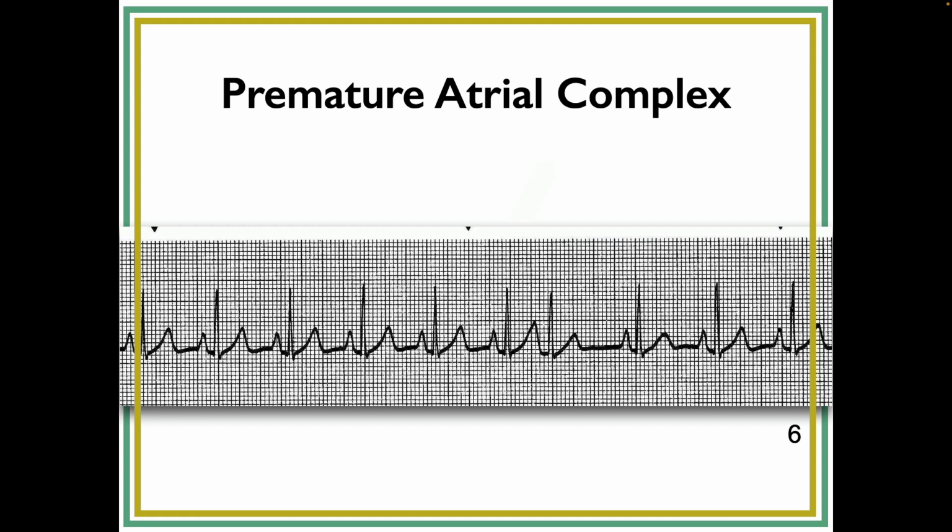However, if you look at the size of this T wave compared to the one previous, there's a very good chance there's a P wave, and that's what's popping the T wave up. So we can't actually see it, but it's implied there. We can assume that it's there, okay? So buried P.